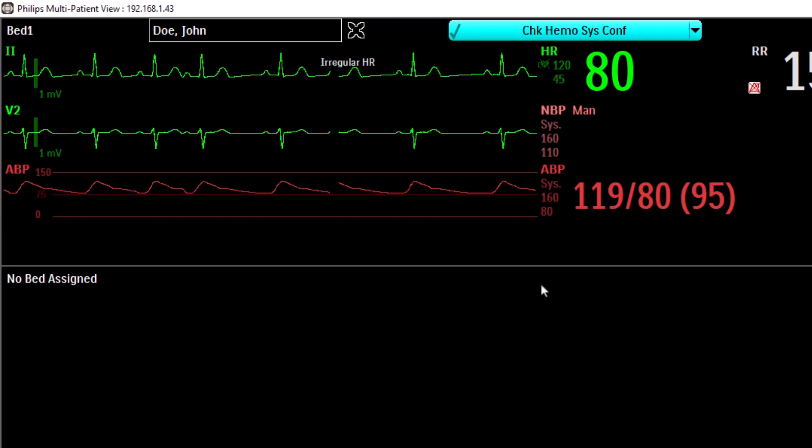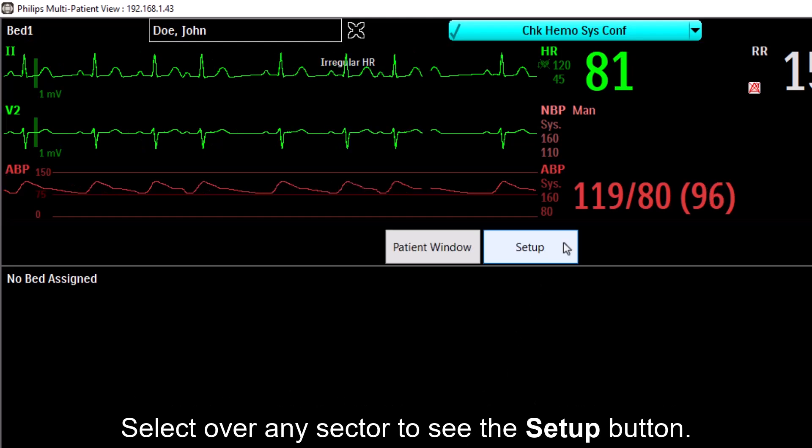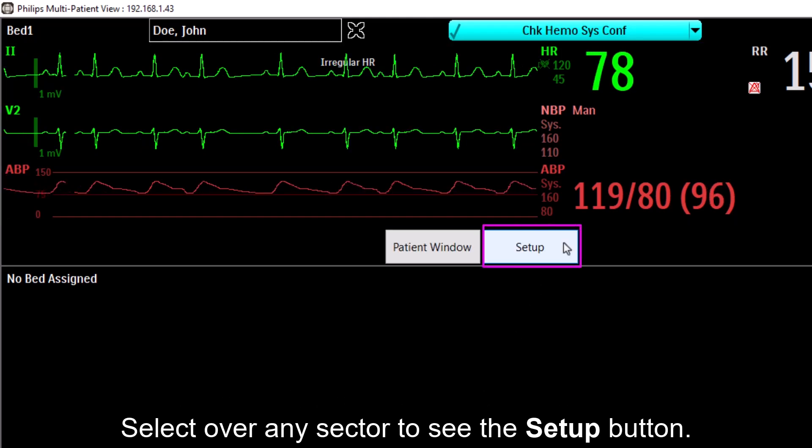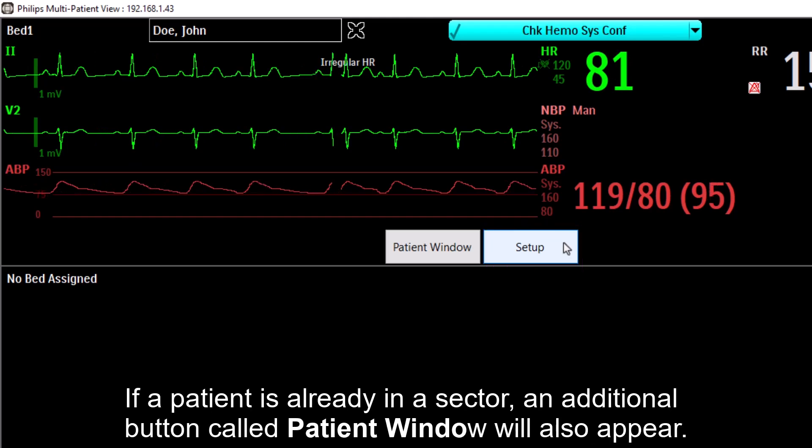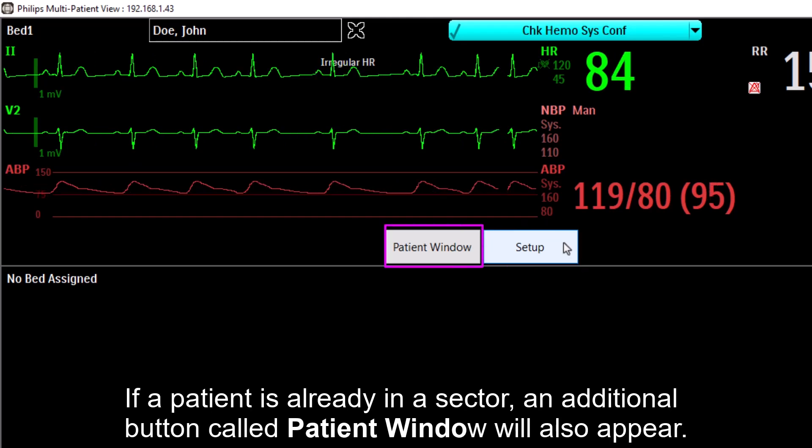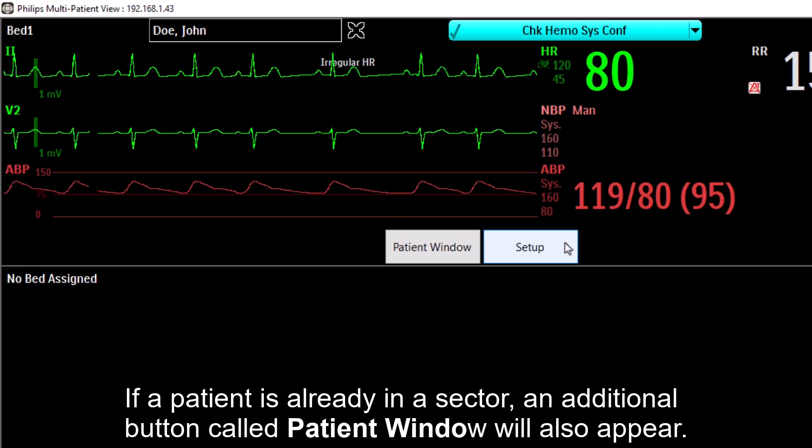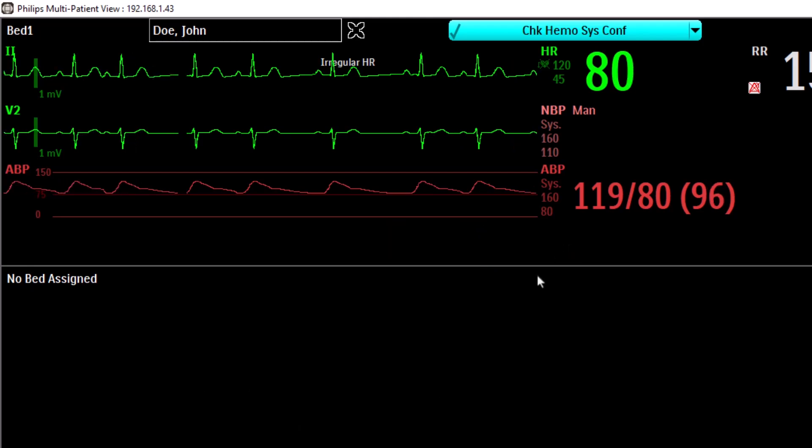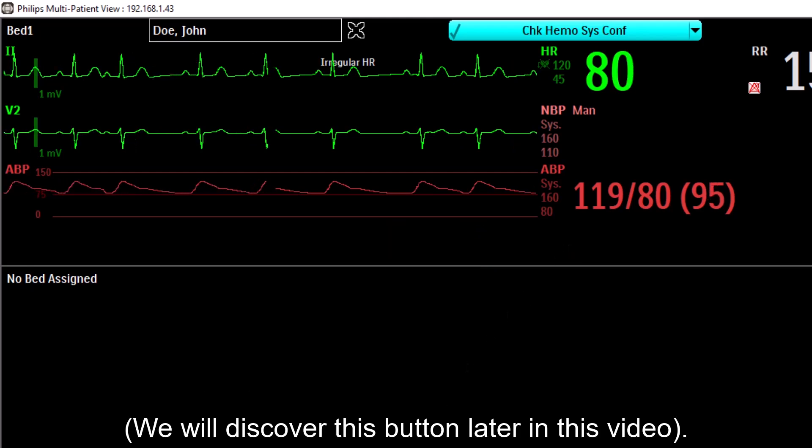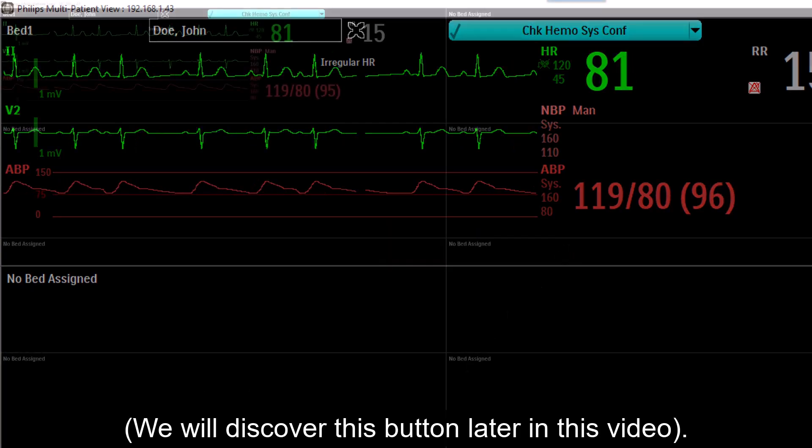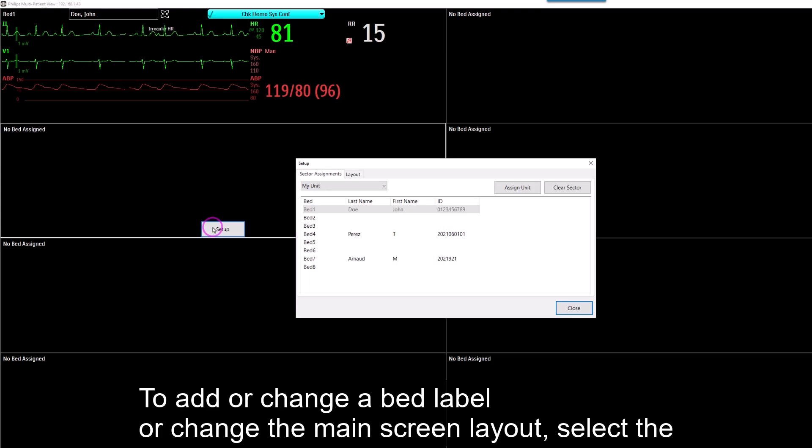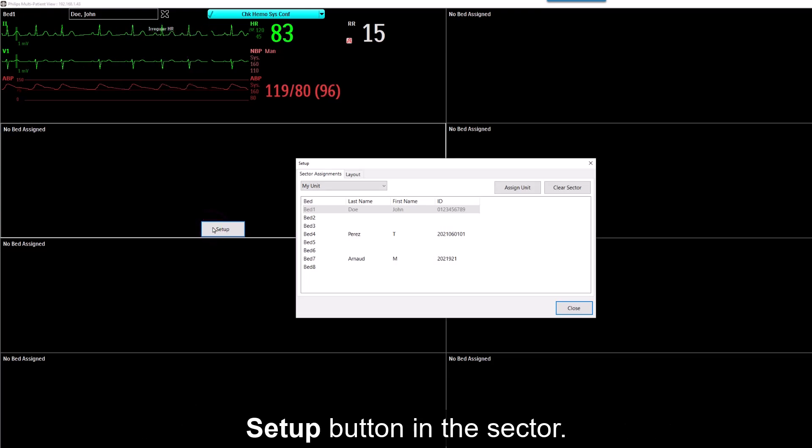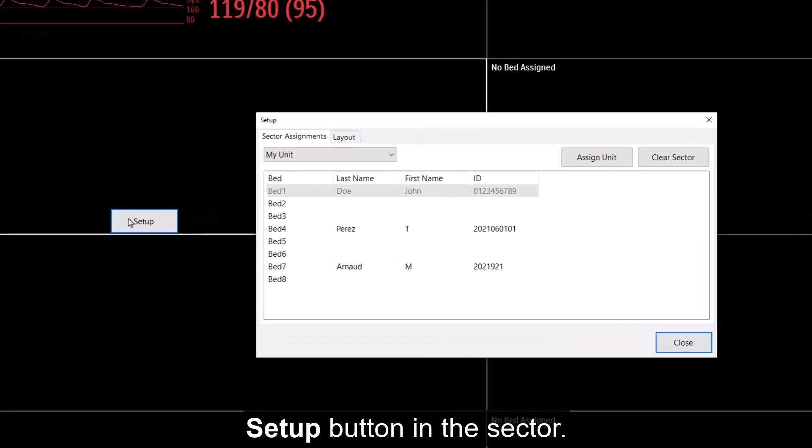Select over any sector to see the Setup button. If a patient is already in a sector, an additional button called Patient View will also appear. We will discover this button later in the video. To add or change a bed label, or to change the main screen layout, select the Setup button in the sector.